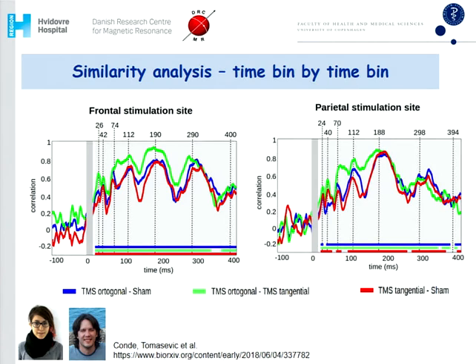So there is a lot of similarity, which challenges the use of this method in terms of looking at connectivity, but also local response profile. So you can use it, but you need to have a realistic sham condition in order to figure out whether your effects are really transcranially induced or whether they are peripherally induced.